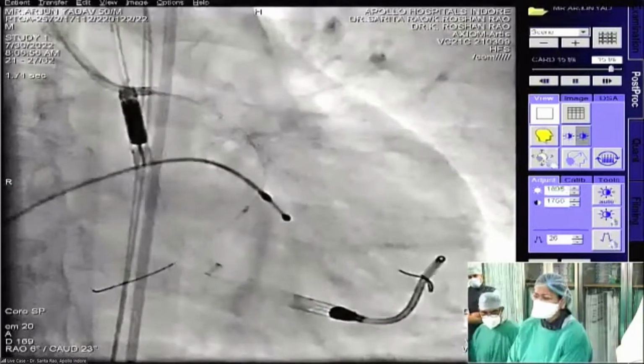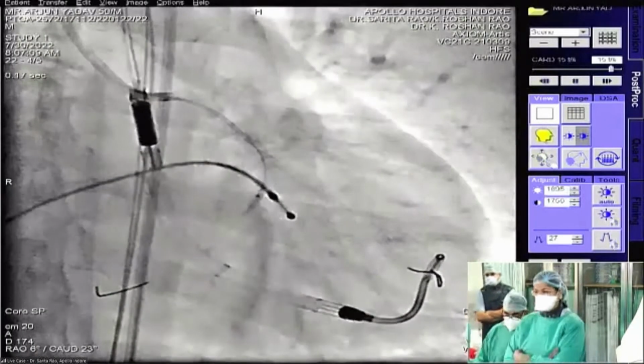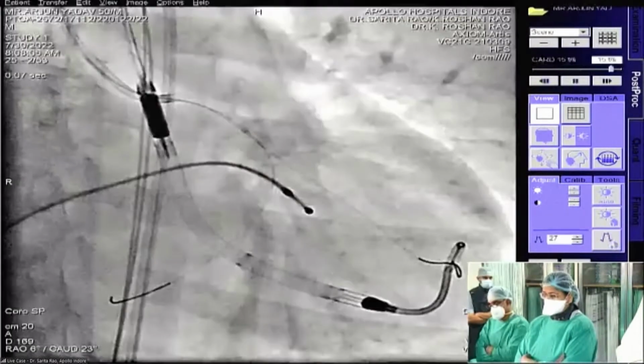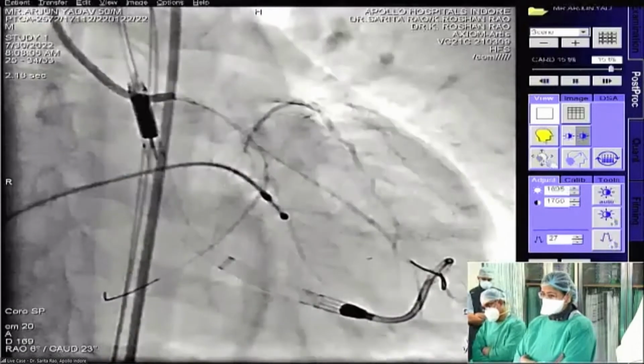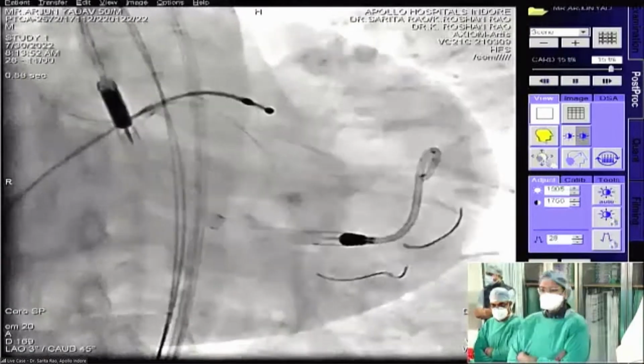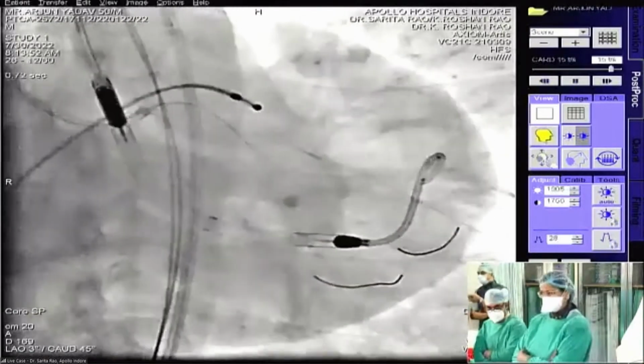So the OM lesion was actually at a trifurcation. We ballooned the other two vessels. So this is post. Went into the middle vessel. We ballooned that as well.